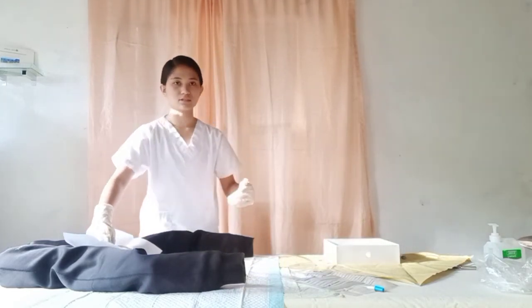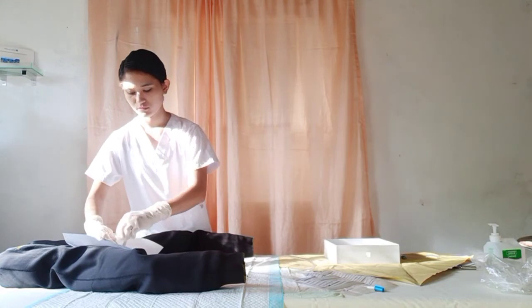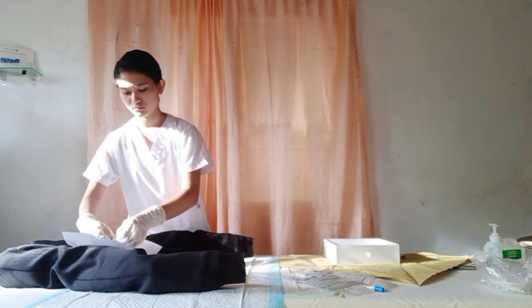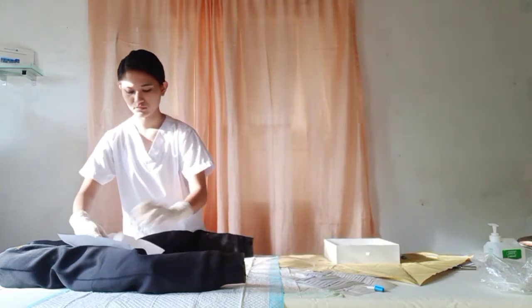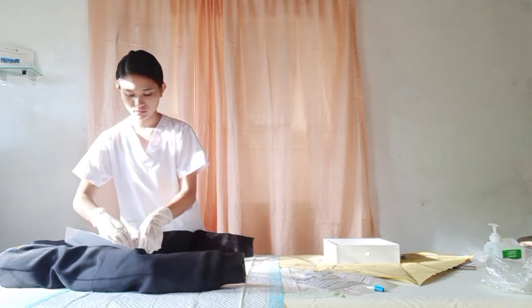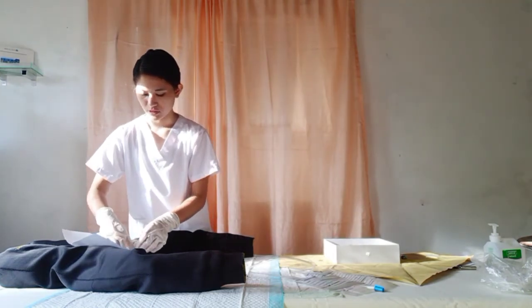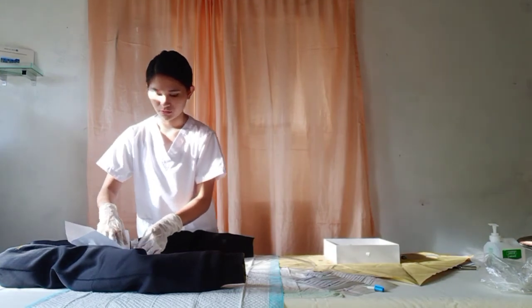And then secure the tubing on the inner thigh of the patient. Mrs. Cruz, I am placing the tubing on your thigh so it will be secured.